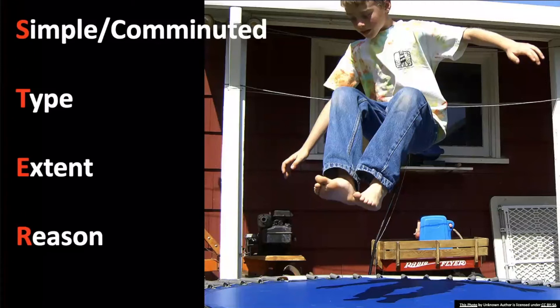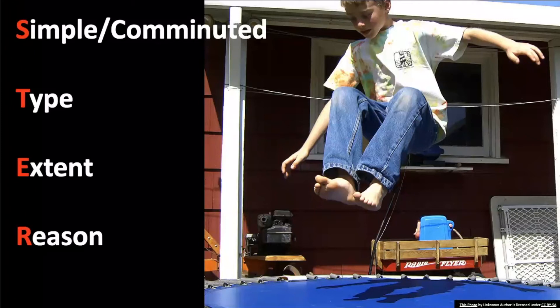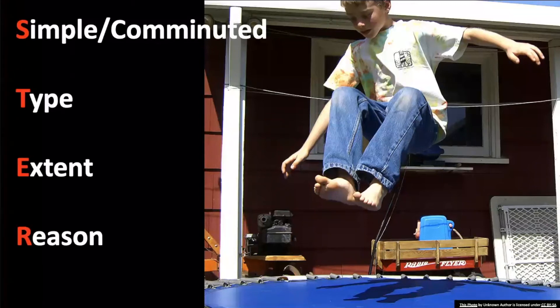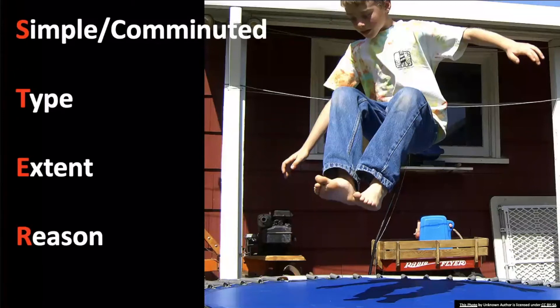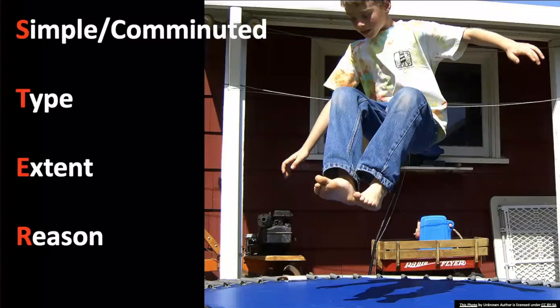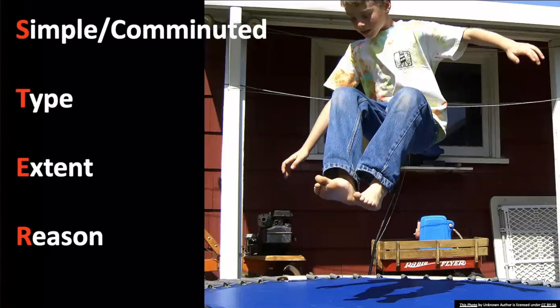Thinking about the extent and the reason. They might have fallen off the monkey bars with a great bendy arm, but have they banged their head — is there something else going on? And we're talking about paediatrics here — you've always got to be thinking: is this a non-accidental injury? Always thinking: does the injury make sense for the child I'm seeing? And locally, everyone will have their local policies about how to approach that.